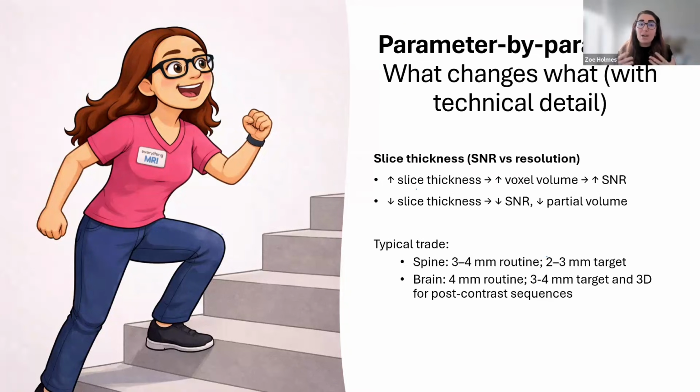What does this do to my time? How much am I blowing out my time? Is my patient going to be able to do this? And then what artifacts am I potentially introducing if I do this? How can I mitigate those? And this is how you develop more protocol intuition.